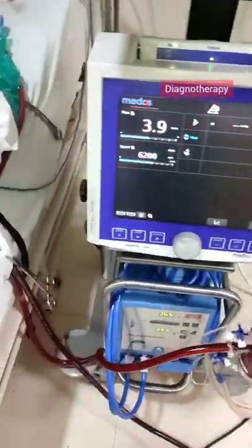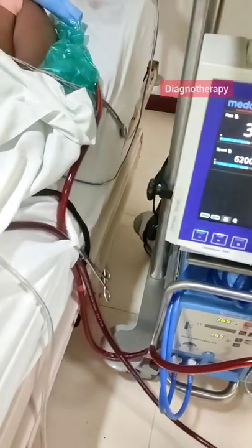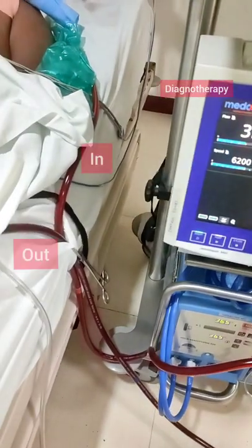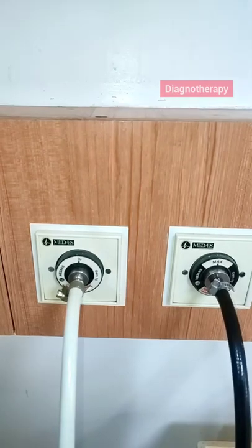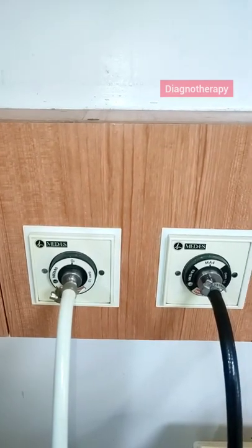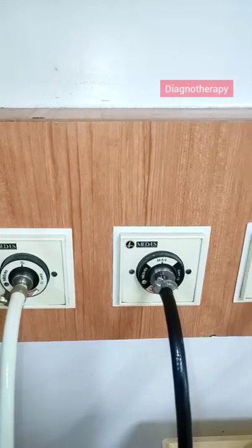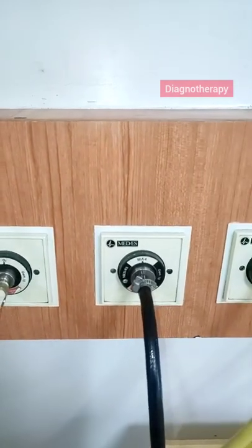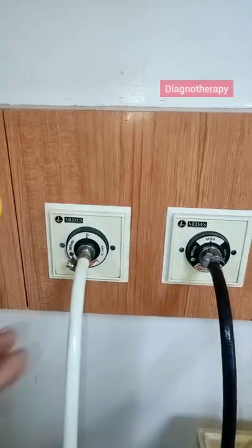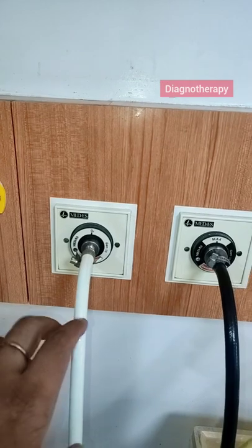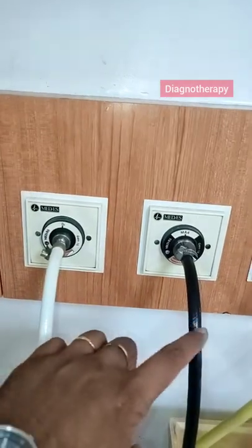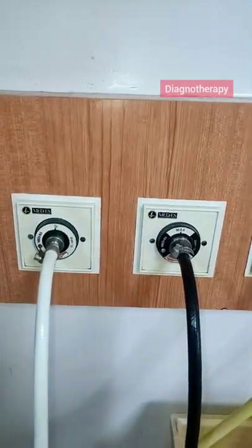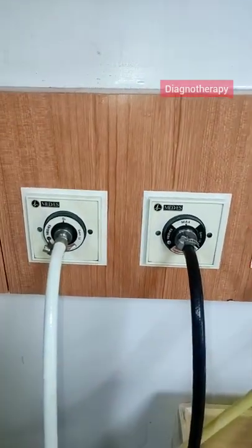From one tube the blood comes out and from one tube the blood goes inside the machine. This machine utilizes oxygen as well as air. We should ensure that both air and oxygen are collected properly and the pressures are equal.